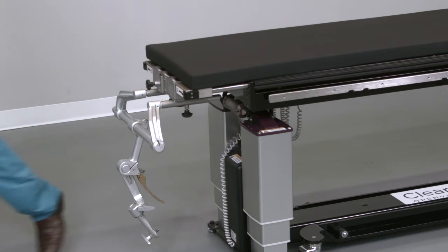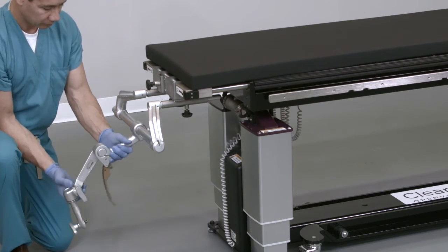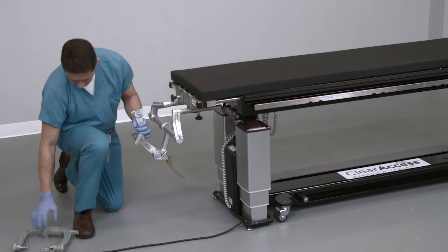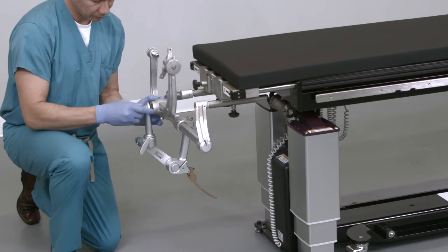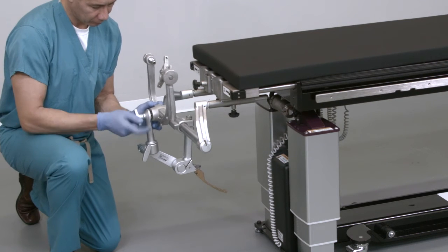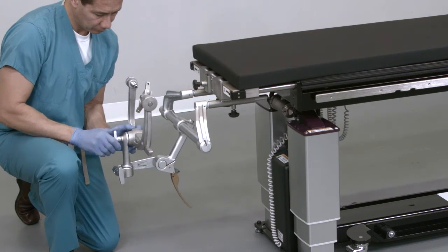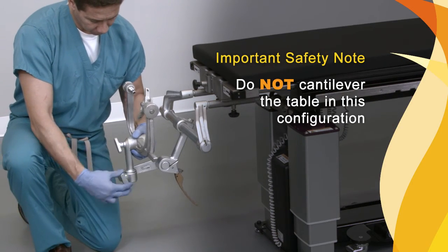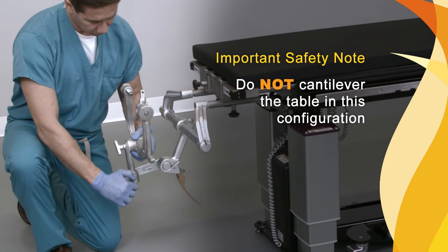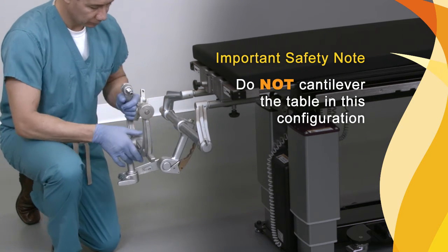Once the adapter and base unit have been installed correctly onto the Clear Access Table, the base unit and skull clamp should be utilized in accordance with the instructions for use of those systems. Most base units accommodate a variety of skull clamp locations. For illustrative purposes, observe how the skull clamp is joined to the base unit and locked into place. Important safety note: do not cantilever the table in this configuration, as this could result in damage to the table, possible injury to the patient, or harm to a healthcare professional.